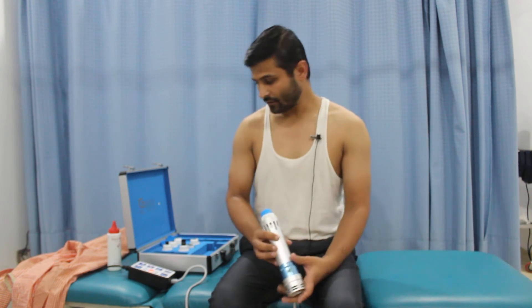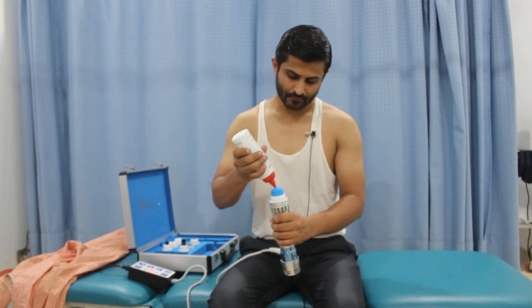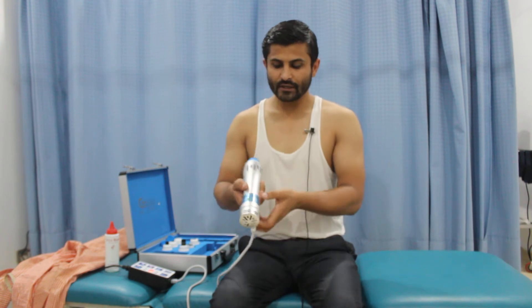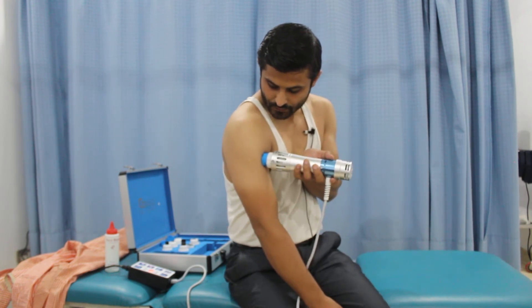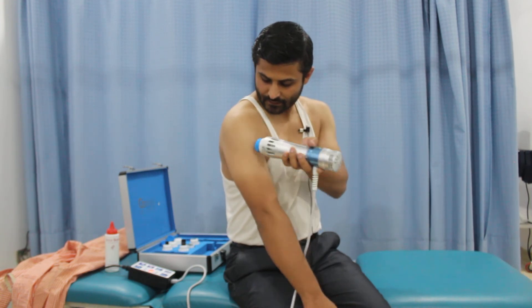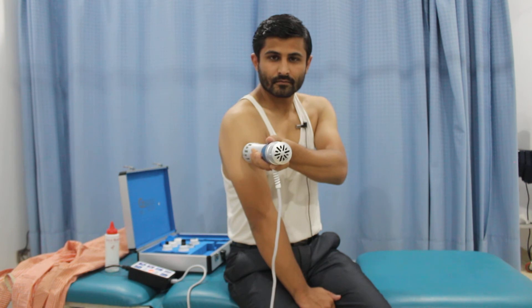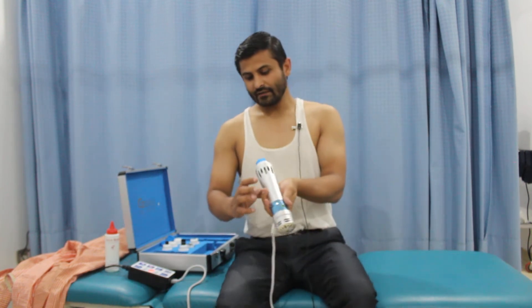You can identify the region with the help of an X-ray or any diagnostic musculoskeletal ultrasound. You need to apply the gel, and before turning on the device, place the head over the target area — let's say over here — and then turn on the unit. It can be placed on other locations as well. It is not causing pain.